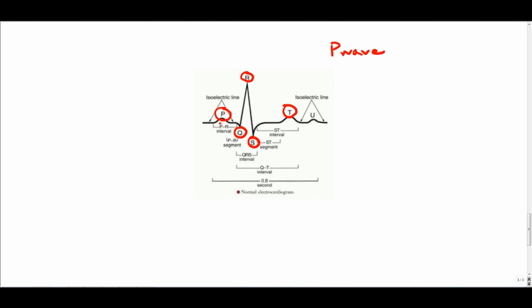As this travels down, this depolarization, it passes the AV node, goes to the ventricles, and creates the QRS complex, which consists of the Q wave, which is the first negative deflection, the R wave, the first positive deflection, and the S wave is the first negative deflection after the R wave.